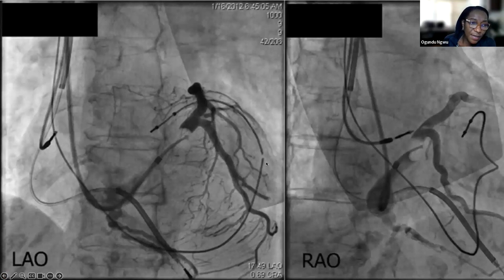As you can see the CS catheter, you can see the venogram and the balloon inflated. And so this lead is going all the way up and down. So this will not be an optimal location for a CS lead. If this patient doesn't improve, you will know exactly the reason is because this lead is not in a good location. You do have options. You do have a lateral branch, a posterolateral branch that will provide a much better option for this lead placement. Next slide.